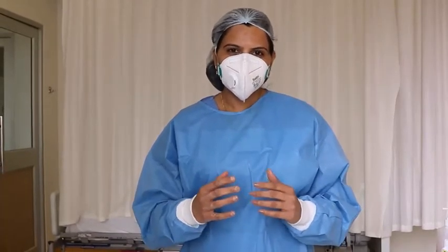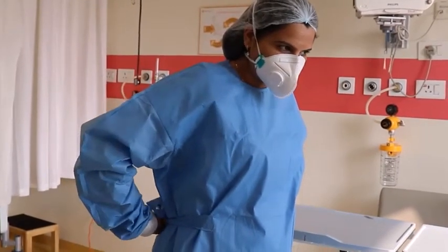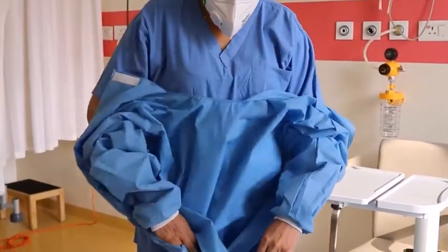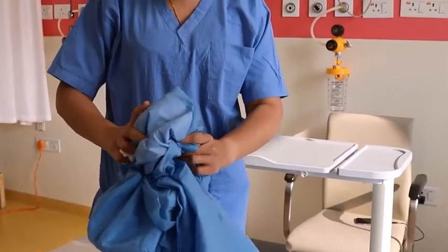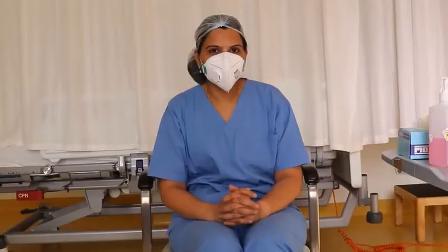Now I will show you how to remove the gown. The front and sleeve parts of the gown are considered contaminated, and the back is considered clean. Untie the gown from the back, remove the shoulders first, then fold the gown from the inside. Make sure you do not touch the front or sleeves of the gown, then discard it.